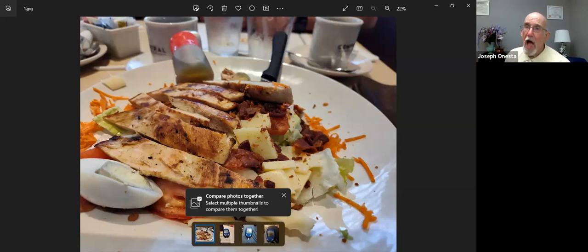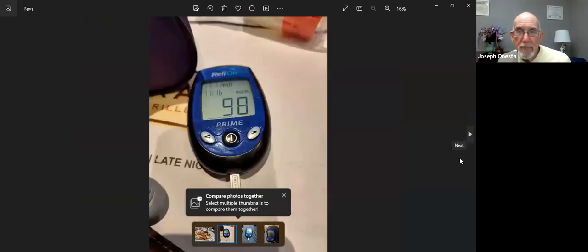And I didn't. Before eating, my blood sugar reading was 84. I don't have a picture of it. I made a little video which didn't turn out, so I thought I was going to do the whole thing on video and it didn't work, which is why I'm doing it this way. But anyway, it was 84. Now on to the next picture, and you'll see at 30 minutes, this is still at the cafe where we were. I went from 84 to 98.